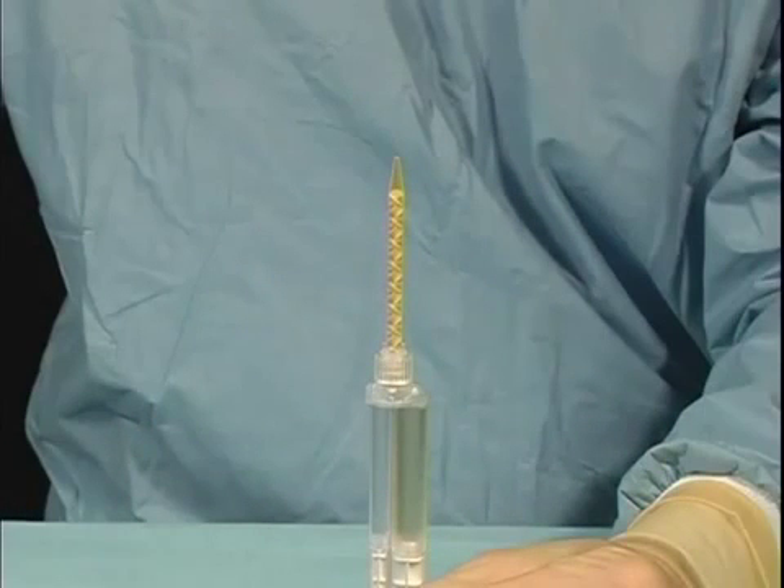During the course of the procedure, the applicator tip may become occluded with polymerized BioGlue. Therefore, it is important to have replacement tips readily available.